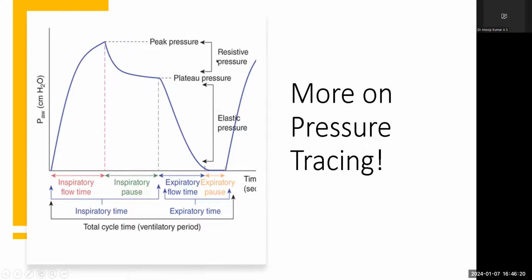If the patient is having a severe obstruction, this trans airway pressure will be high, but your plateau will be normal. But in an ARDS patient, your plateau will be more or your compliance will be poor. So whenever your compliance is poor, your plateau will be high. Whenever your airway pressures are high or whenever there is a resistance, peak pressures will be more. And the difference between the plateau pressure and the PEEP you are keeping is called the driving pressure, which we always try to keep somewhere around 15. So we have driving pressure, plateau pressure, and peak pressures.